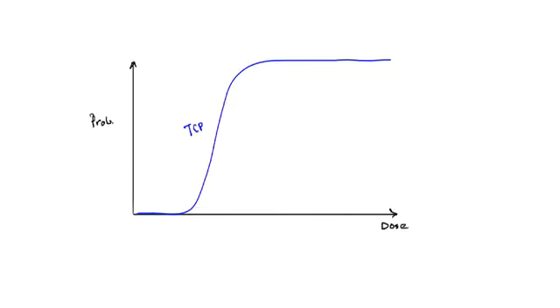The second kind of curve might have a similar shape, and that would describe the normal tissues that you want to spare, NTCP here, for example. The split between these is called the therapeutic window. That's where you can safely irradiate and achieve tumor control without the complications. So one of the major goals of advancing radiotherapy is to push these two curves apart.